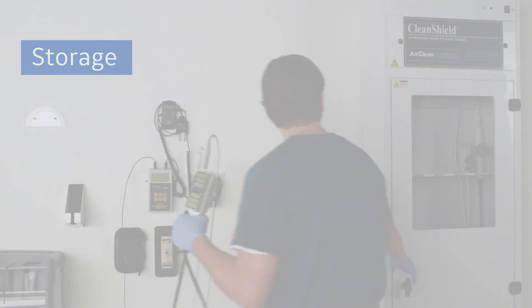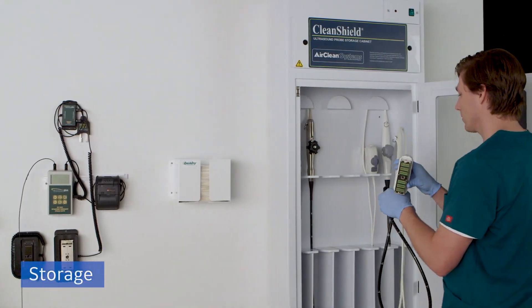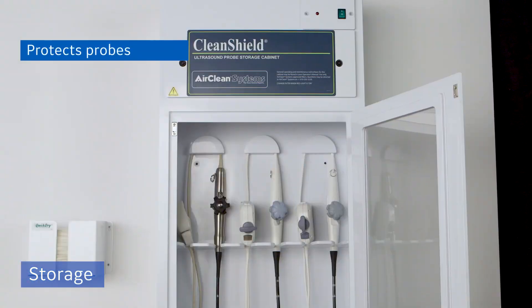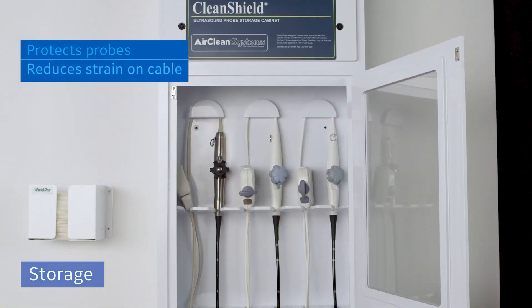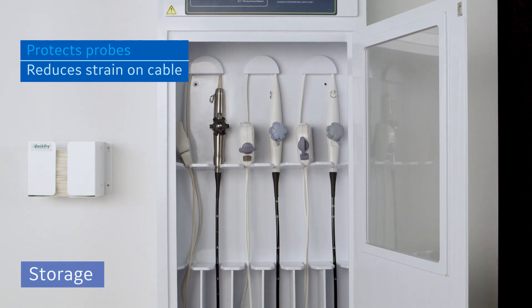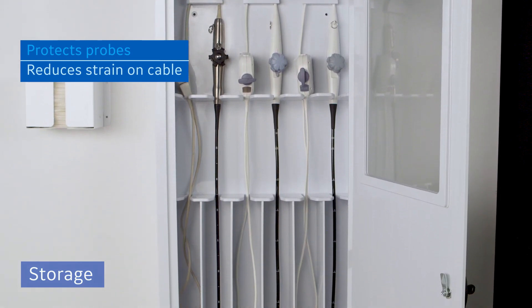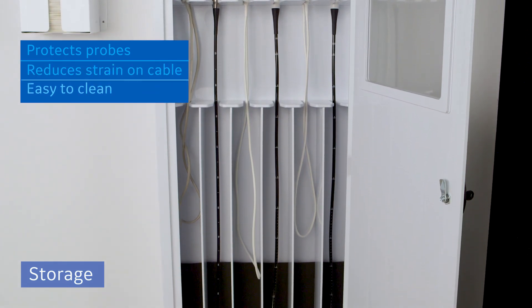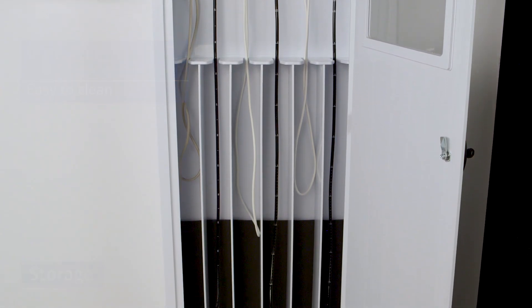The storage cabinet can be used to store the probe after disinfection. Barriers keep the probe shaft separate from the probe cable and handle. Crescent holders help reduce strain on the cable. Pre-filters and HEPA filters constantly bathe the probe with clean air. It is constructed of polypropylene and is easy to clean. A locking door and a see-through window keep your probe secure.